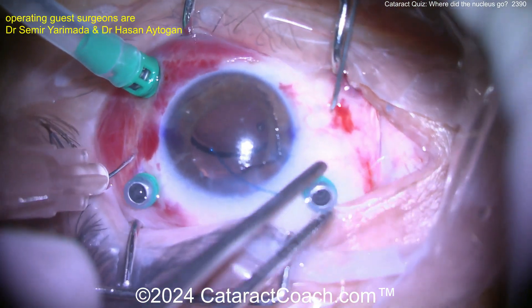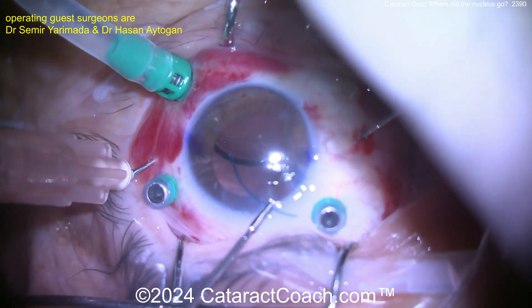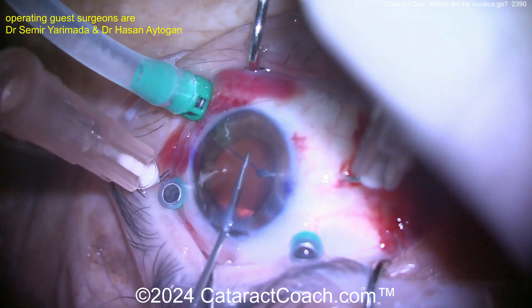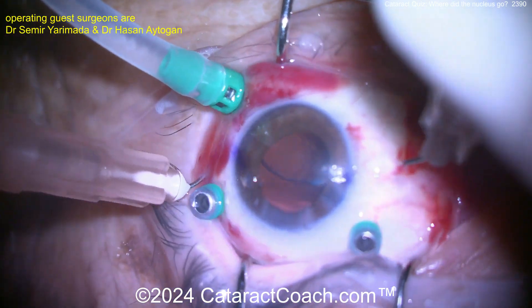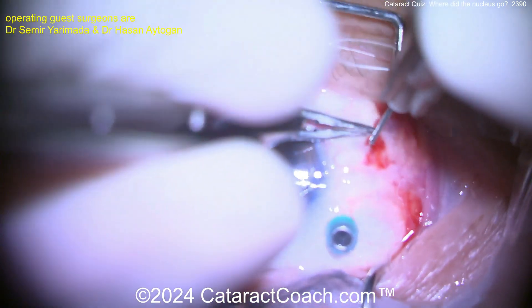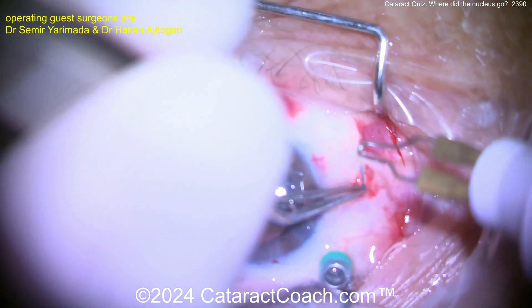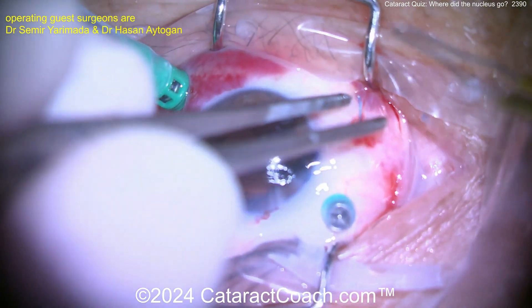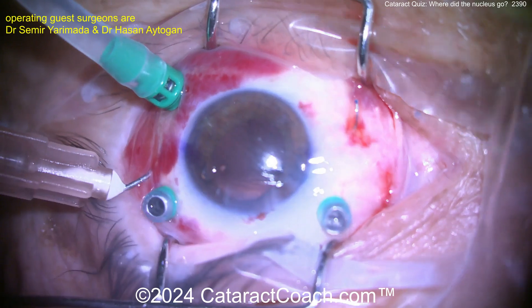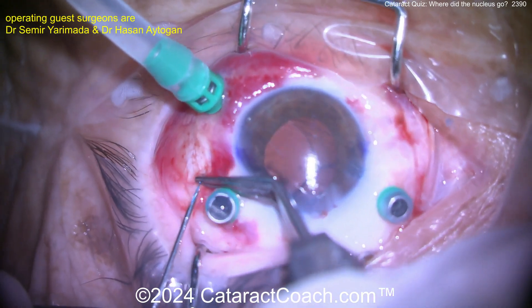I was talking to a retina colleague who says he's now starting to see more complications from Yamane procedures, such as late dislocation, rotation of the haptics, and tilting of the lens. Not a perfect surgery — it's all relatively speaking. A little cautery here to create a flange, and make sure you get these flanges within the sclera so the patient can have a reasonable outcome.